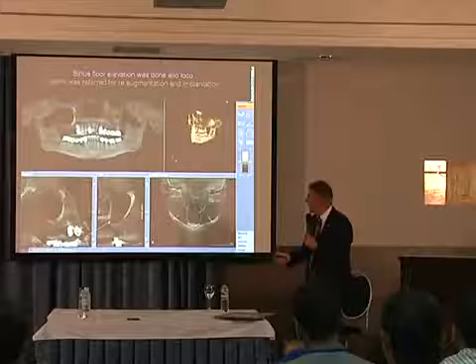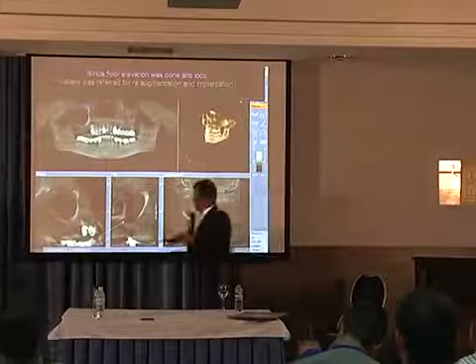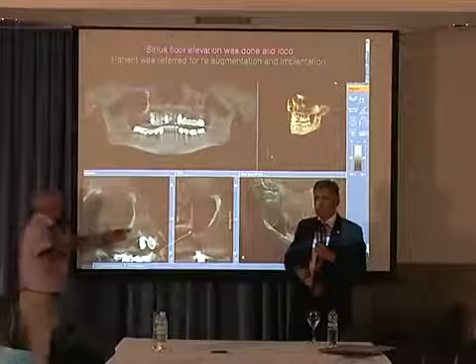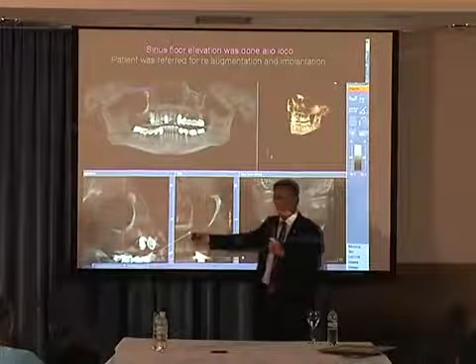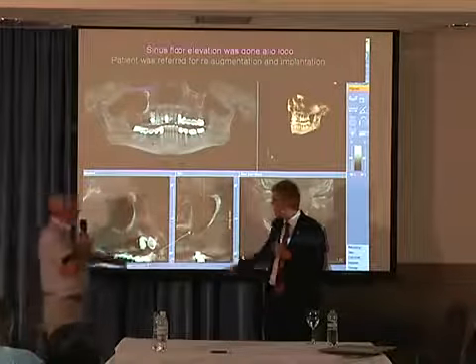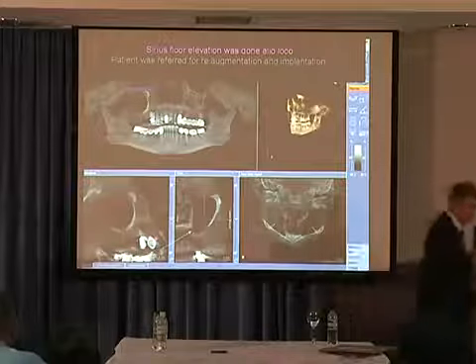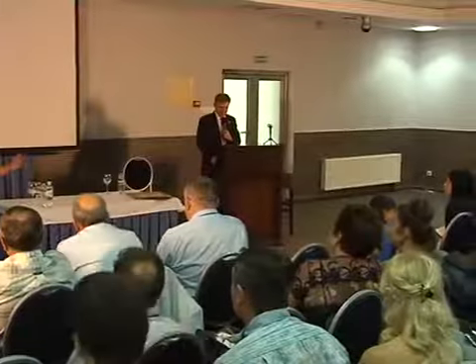Thanks God, 3D. Спасибо, 3D. I couldn't identify any bone here augmented in the sinus. Я не смог найти ни одного, как говорится, не то что крошки костной ткани, которая бы имела место в этой гайморовой пазухе. But we could identify this. What is this? Но он никак не мог разобраться, что вот это такое. It's a hole in the bone and a hole in the Schneiderian membrane. It's a perforation. В конечном итоге он установил, определил, что это отверстие в костной ткани и в мембране.